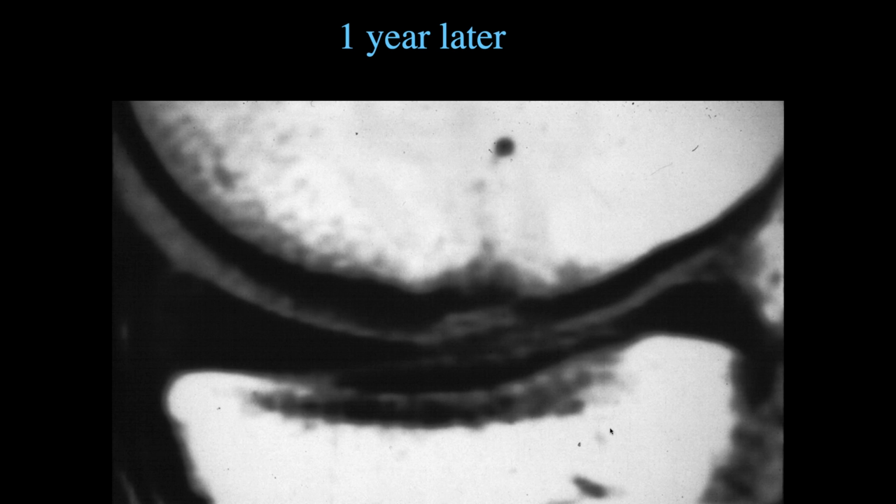Okay, so here we have this chronic osteochondral lesion. It looks like there may be some cartilage now. I wonder if he had a procedure. Yes, he didn't have a procedure at that time. There really weren't a lot of cartilage procedures back around 1990.